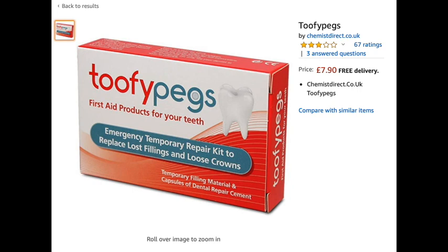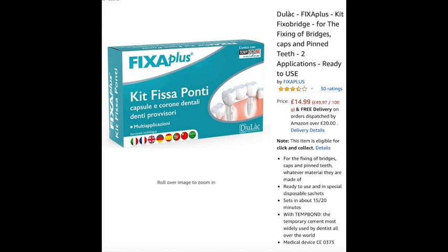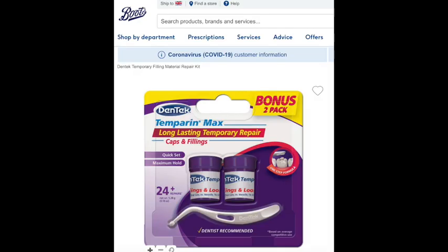Right, let's now talk about loose crowns, bridge work or veneers. You can buy temporary cements online. These are very easy to mix. Please remember, these are only temporary. They are not going to last forever, but they are just meant to hold it together for you and buy you some time. Please do not use super glue. Do not use any other glue that's not meant to be for dental treatment.